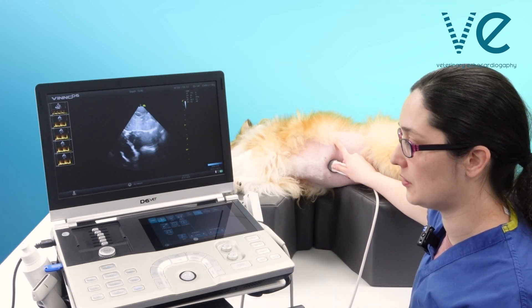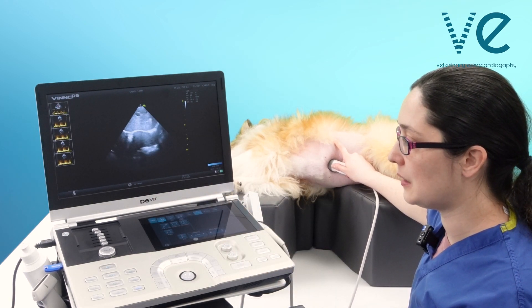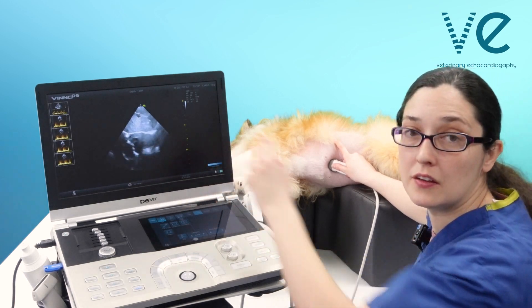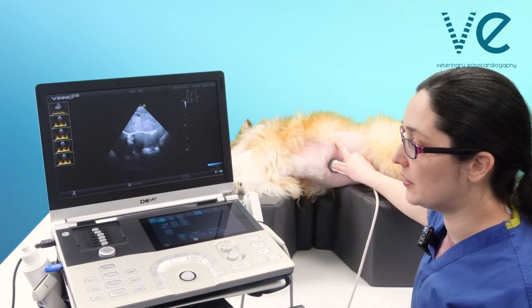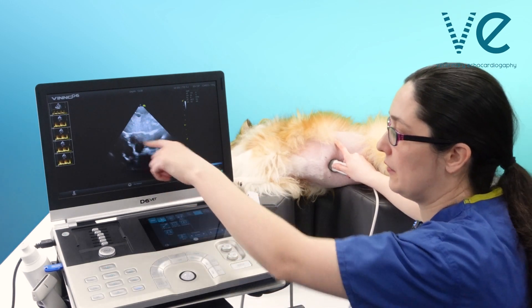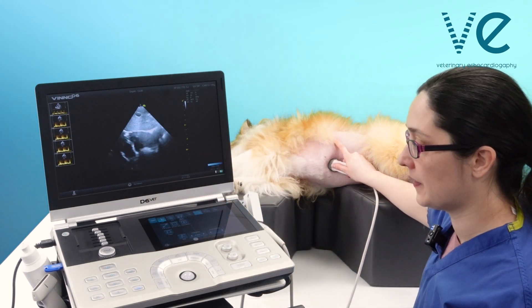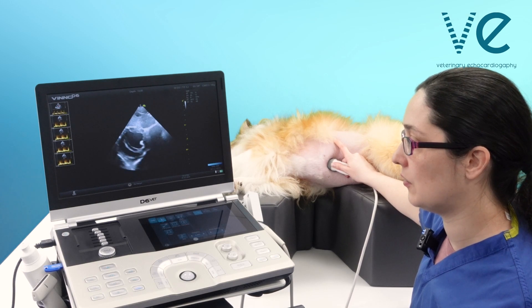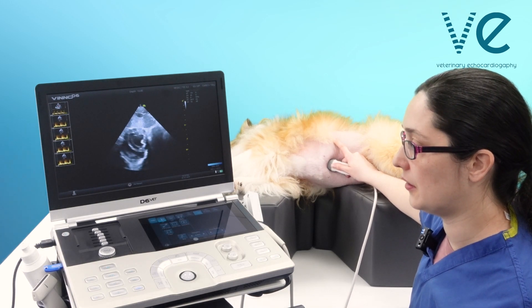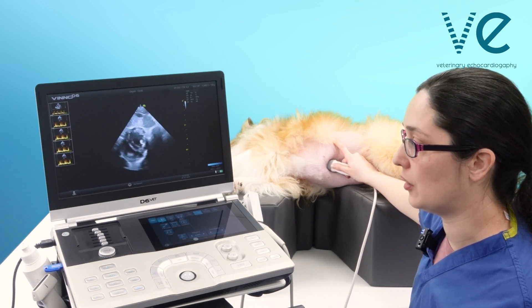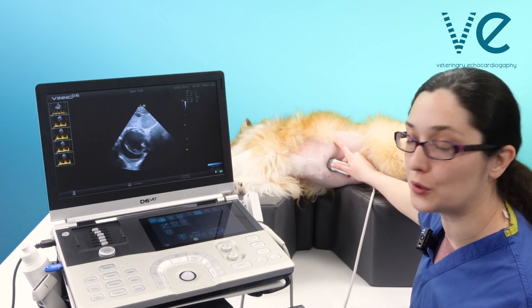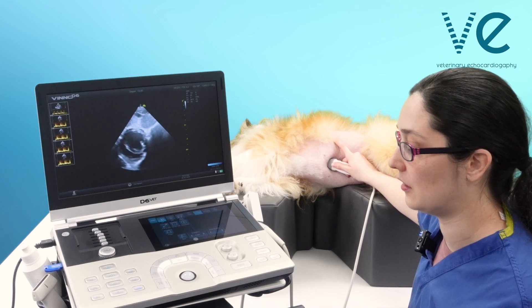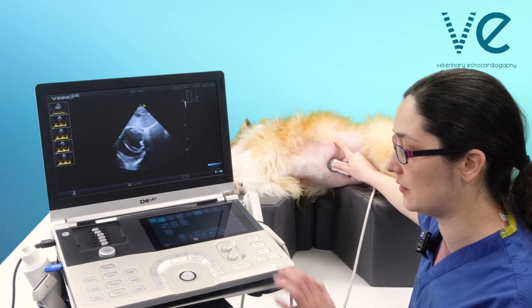If you are pointed too deep you'll just be catching the top of the ventricles and then you get all the liver. If you have too shallow an angle you're going to get a double short axis — so both ventricles in a kind of a short axis.